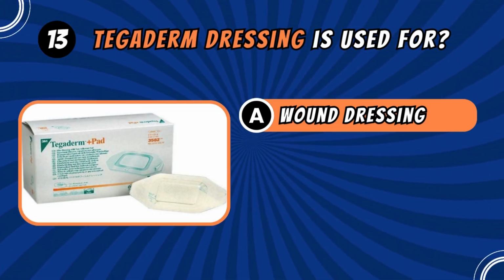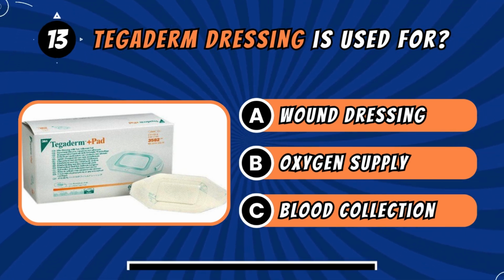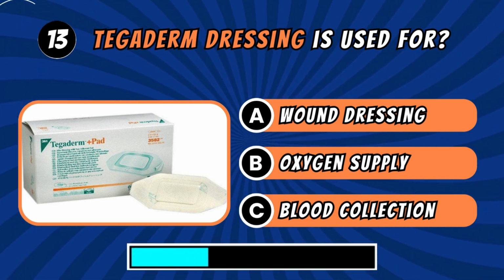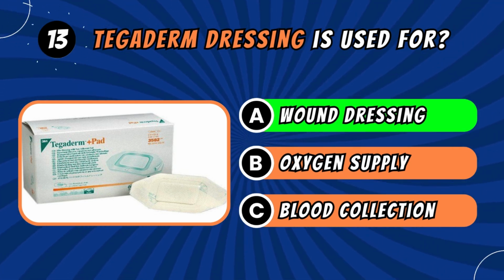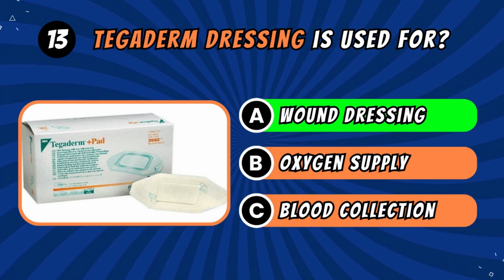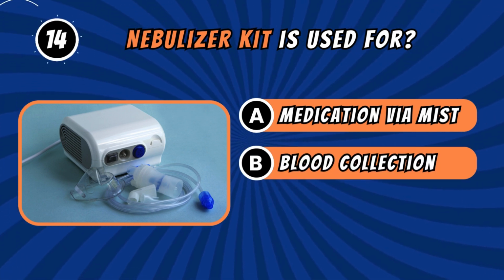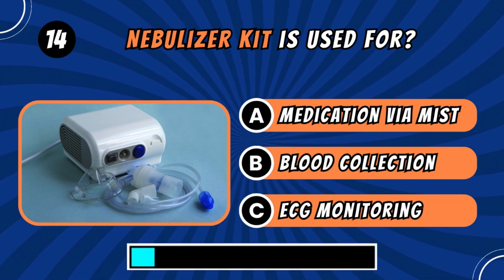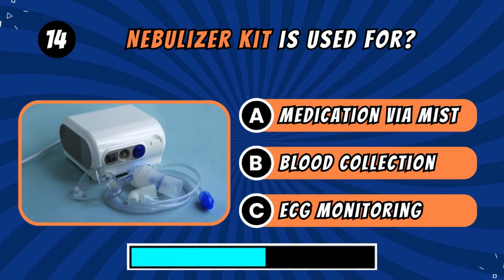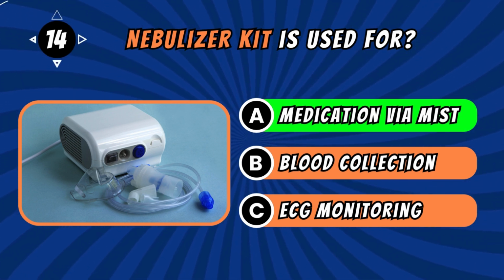Tegaderm dressing is used for? Answer A. Wound dressing. Nebulizer kit is used for? Answer A. Medication via mist.